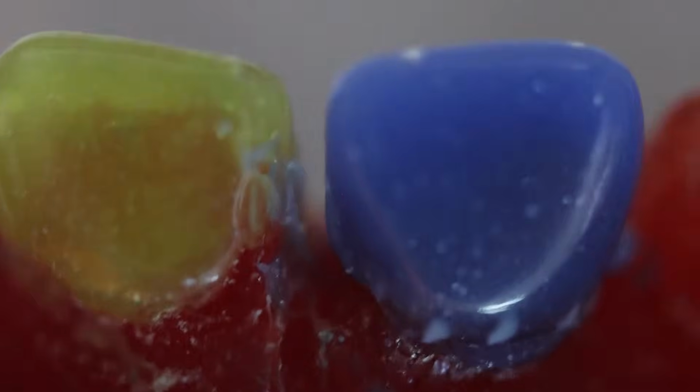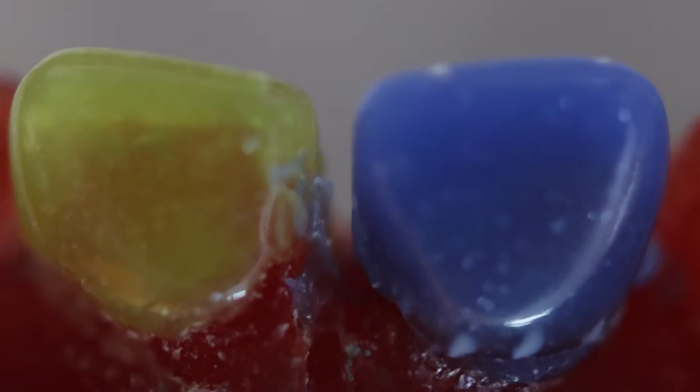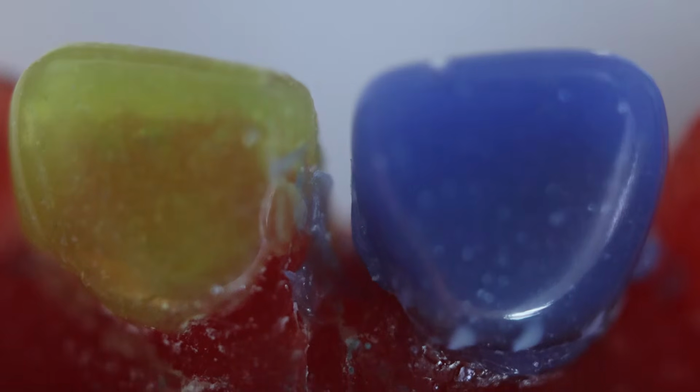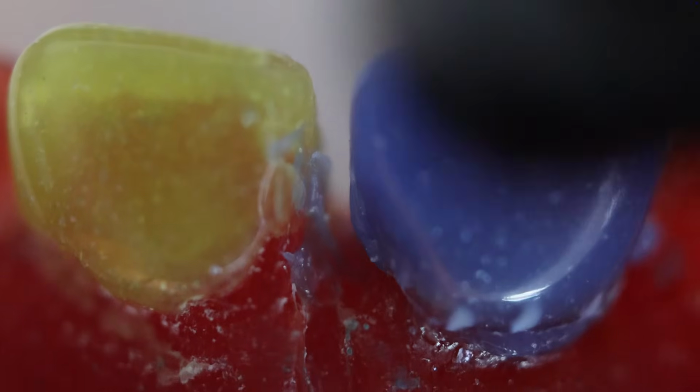So this completes our fourth step, and now coming to the fifth step, and this fifth step is curing it. So we will use the light cure now to cure the composite. Just a minute, there is one more part hanging around over here, otherwise we will need the bur.